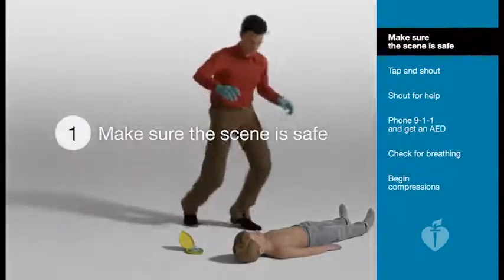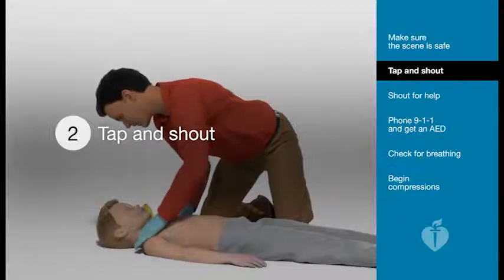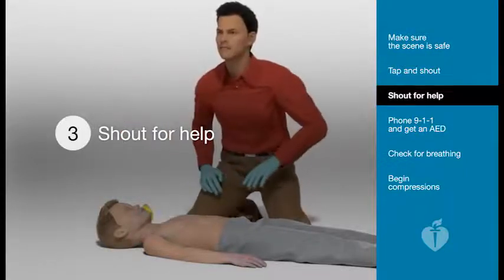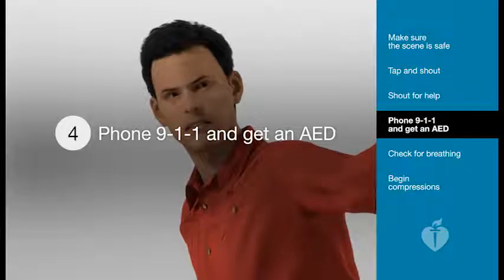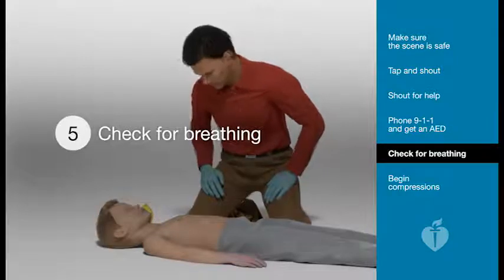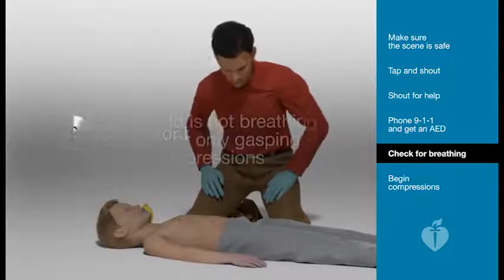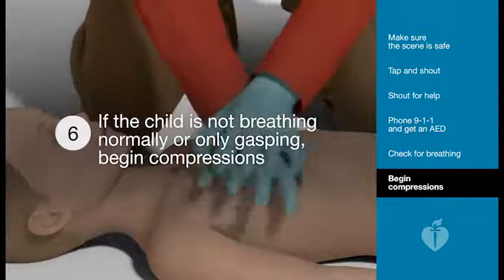Make sure the scene is safe. Tap the child on the shoulders and shout to see if the child is responsive. Shout for help. Tell whoever comes to phone 911 and get an AED. Check for breathing. Scan the chest for 5 to 10 seconds. If there is no sign of breathing or the child is only gasping, begin compressions.